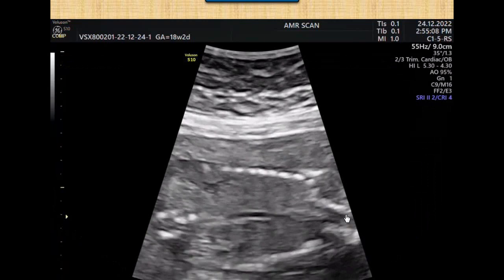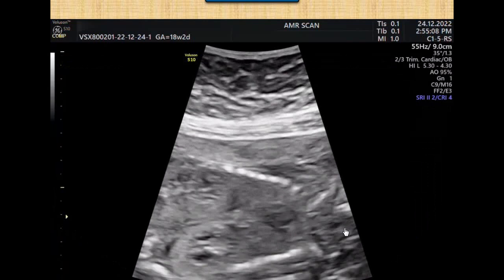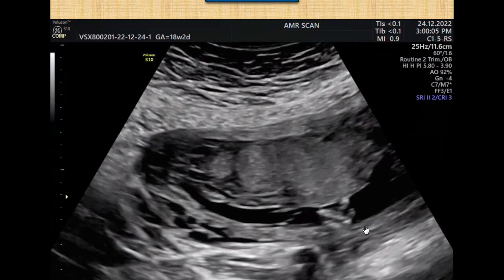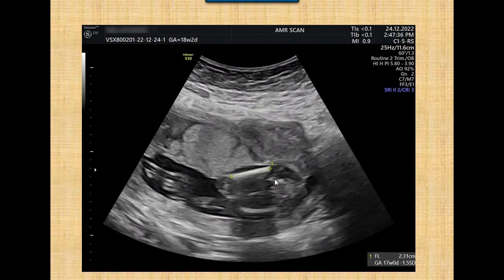Again, the fetal kidneys are significantly enlarged and polycystic. Here is a cine loop to show that the fingers of the baby are of normal count and there is no polydactyly. Also, cine loops of feet show normal toe count, but not shown here. Mild to moderate shortening of the femur length compared with other biometry is noted. The femur length is at 17 weeks gestational age.